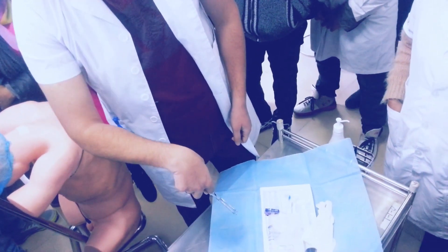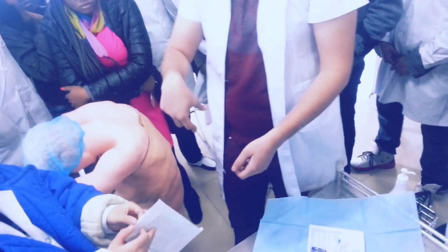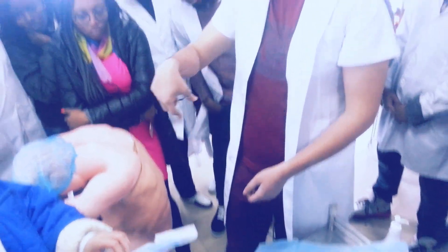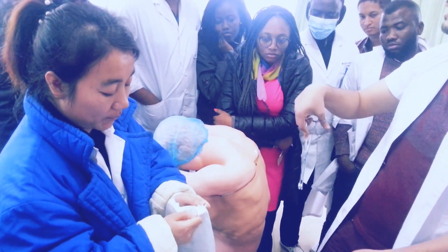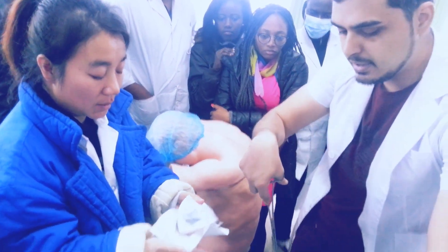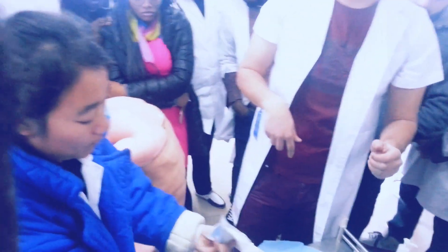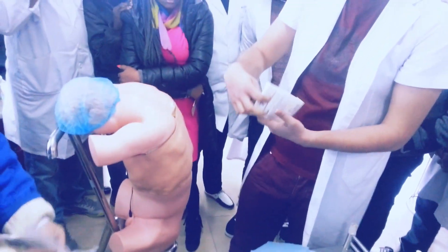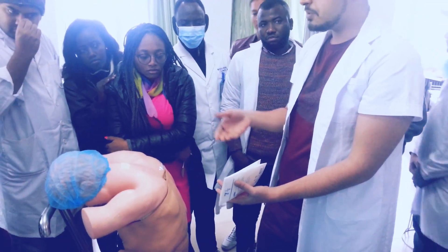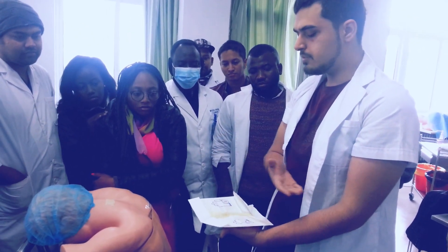Seven and a half — the glove size is seven and a half. When you are opening the glove, it's preferable if you take it like this in one hand and open them. This is the left side, right side.